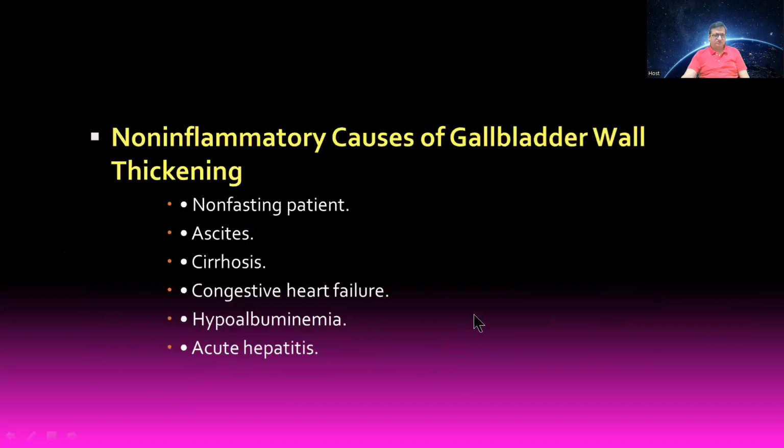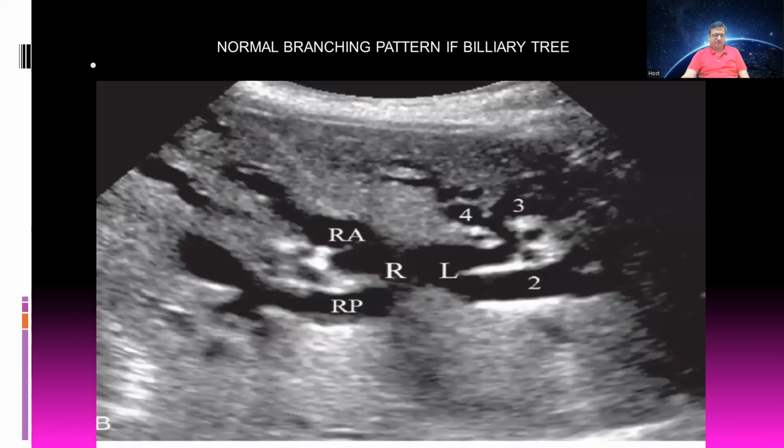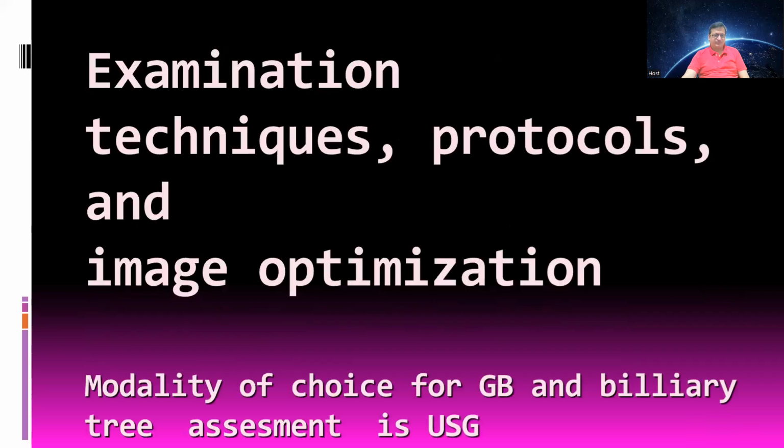Now, these we have already discussed. Next is the sonographic appearance of the gallbladder and biliary system. So, examination technique and protocol and image optimization.